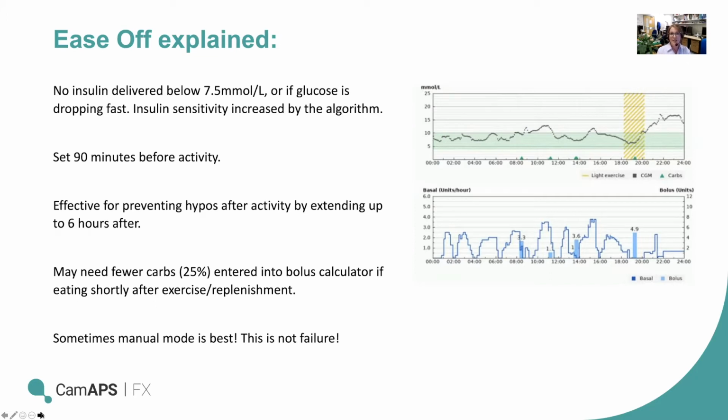And it can be really effective to keep that ease off going as well. We saw earlier that some of those transporters in your body that are used to help bring the glucose into the body where it can be used as energy, that effect can last for several hours later. And we certainly know that afternoon exercise can really increase the risk of going low overnight. So in some cases, we say to people, put the ease off even overnight, put it on for 6 hours overnight. You can always learn from experience. If it doesn't work, you could always change your strategy for next time.